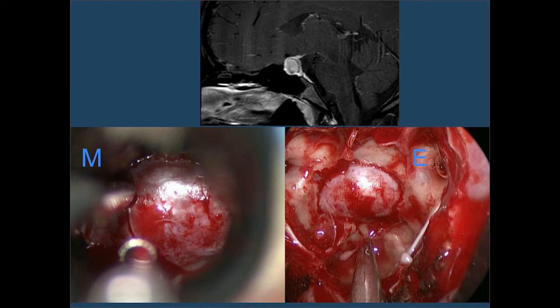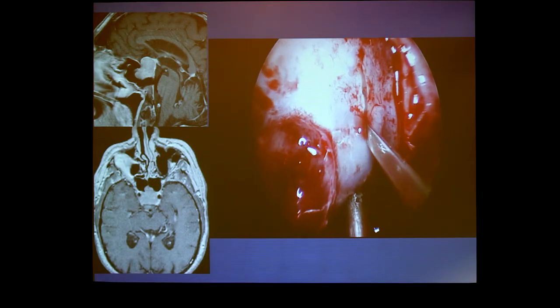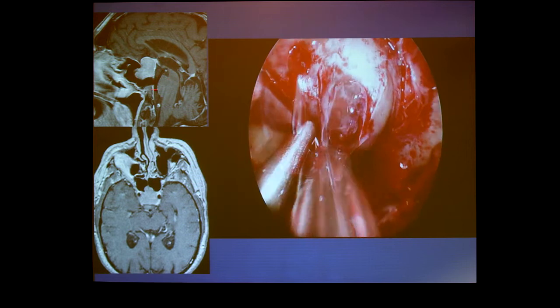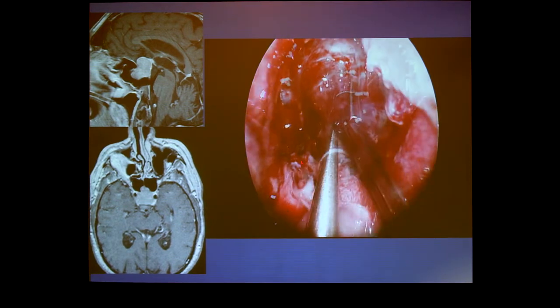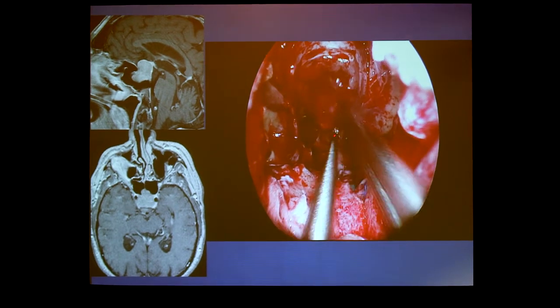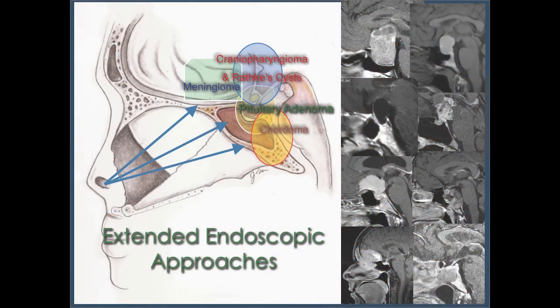This is the beauty of the endoscope over the microscope. Looking in with the microscope through a speculum, you get a decent view of the dura. With the endoscope, you get a much more panoramic view — you can see beyond the bone edges, locate the carotid arteries under the bone, and see where the optic nerves are hiding behind the bone. That's really why we've switched. Two instruments come in — one from each nostril — while the endoscope is held back, giving us that beautiful panoramic view.